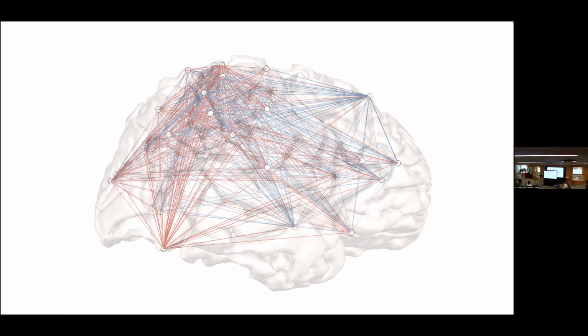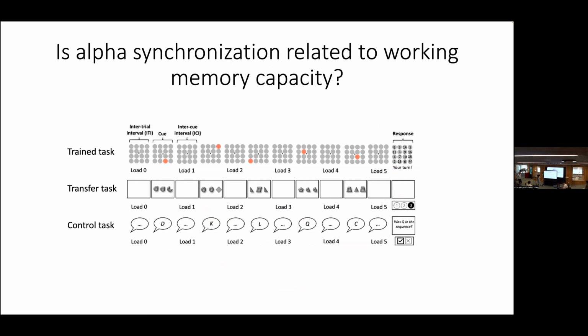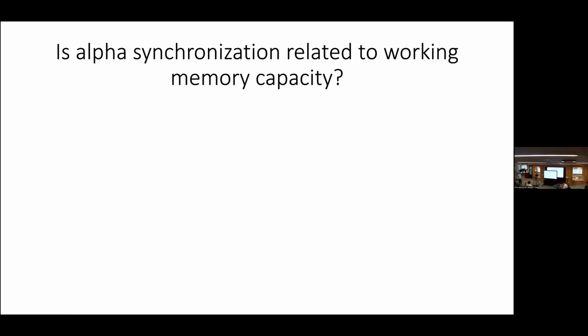So on a single trial basis, you get very noisy estimates, because we just have 1 second anyways. Of course, that would still take an average over all the trials. But I have done it within single trials as well, but from the equation, it's not really great to just do within 1 second.